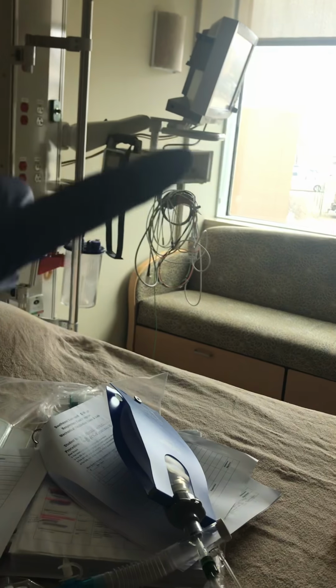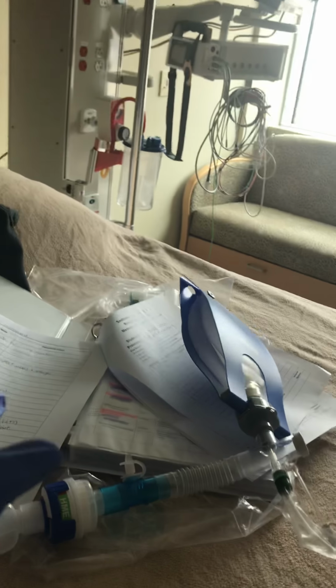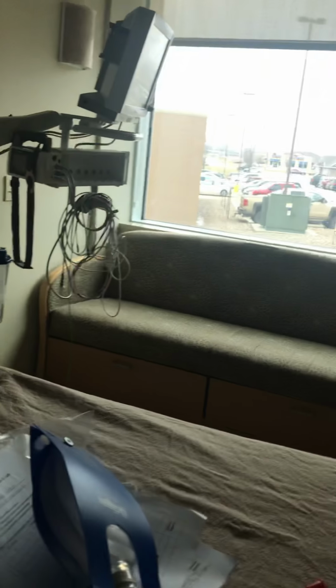We also want to take this time to make sure we're watching our monitor, our O2 stats, our pulse, if it's rising or falling, if there's a blood pressure. If any of those things alter, we need to make sure we let the nurse or physician know, because those are pretty important things.